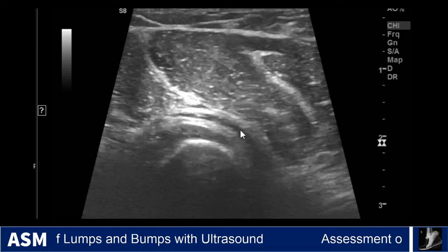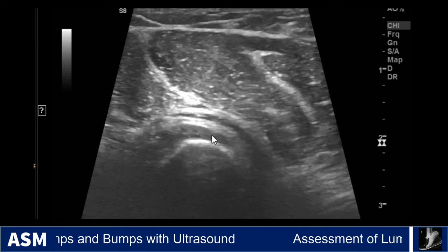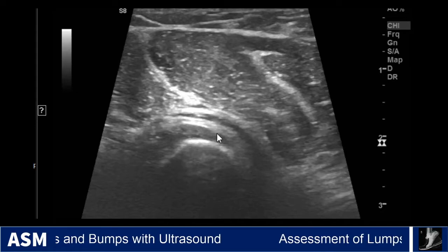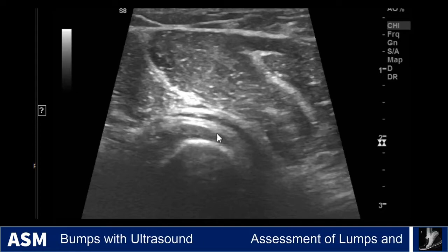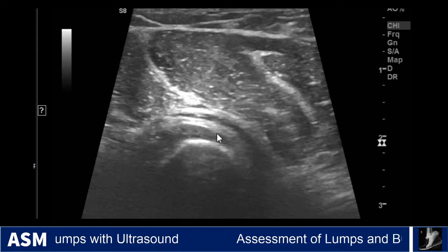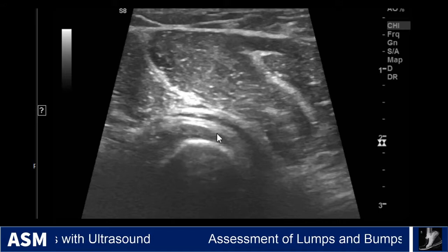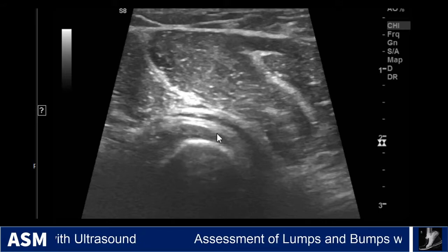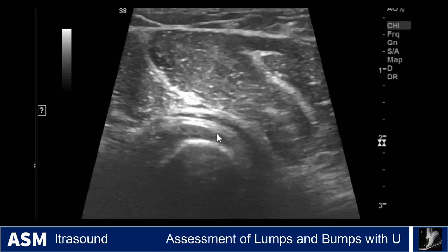Case 14 is a female patient with a mass involving the left forearm region. I'm going to start on the right side just to give an idea of normal for this patient.